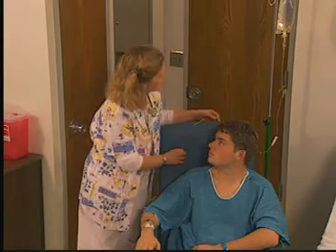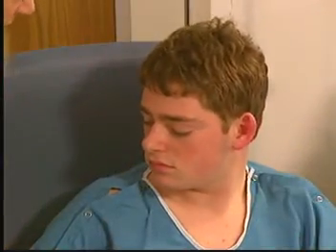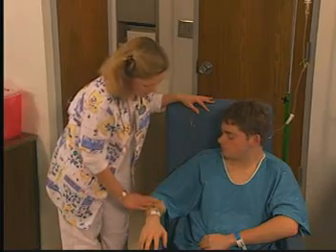Mr. Schwartz, I don't see anything impeding the flow of your fluids right now. They seem all right. One thing I want you to be careful of, though, when we do get you back in bed, is to be careful not to lie in any of the tubing so that it doesn't become kinked and slow down the rate of your fluids.